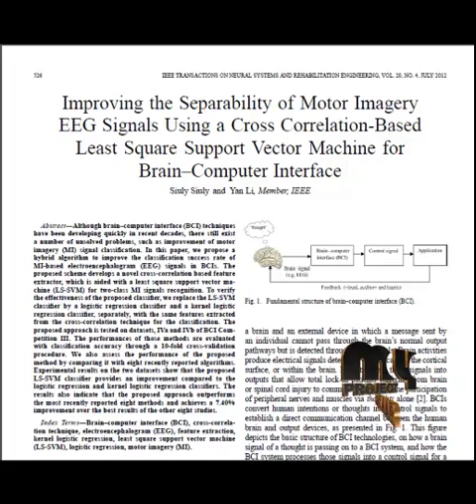Least square support vector machines are the least square versions of the support vector machine, which are a set of related supervised learning methods. They analyze the data and recognize the patterns, and they are used for classification and regression analysis. This finds the solution by solving a set of linear equations instead of a convex quadratic programming problem as in classical SVMs. Basically, it categorizes the train image features based on the similarities between the features and then arranges them in a single category.